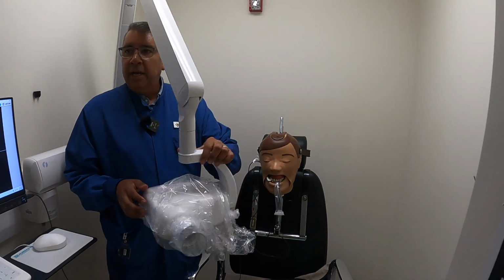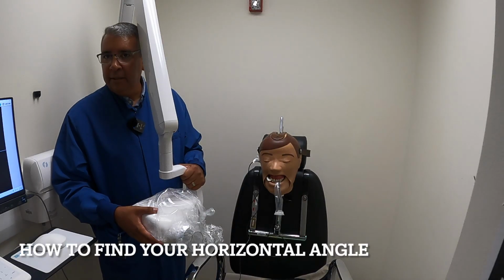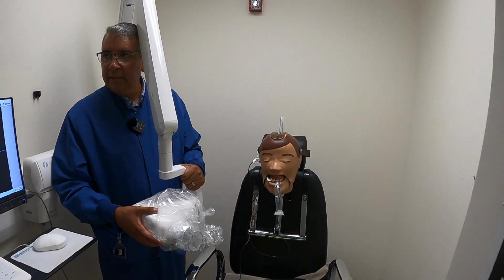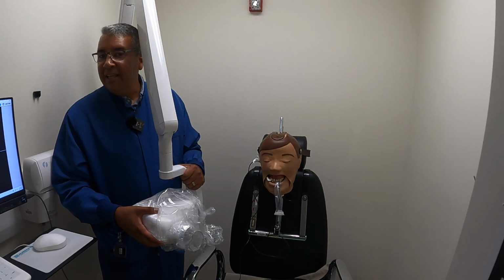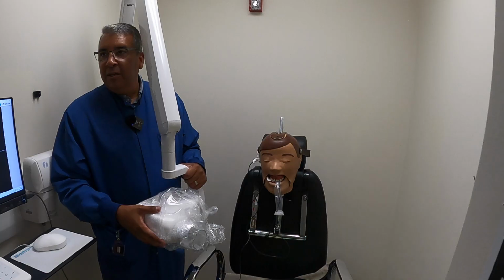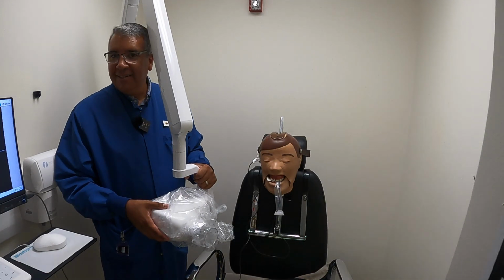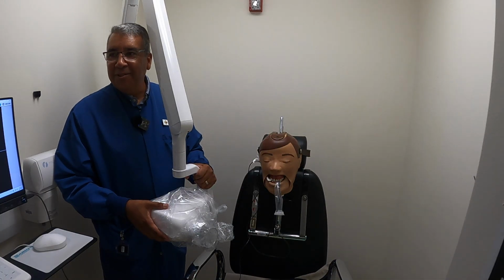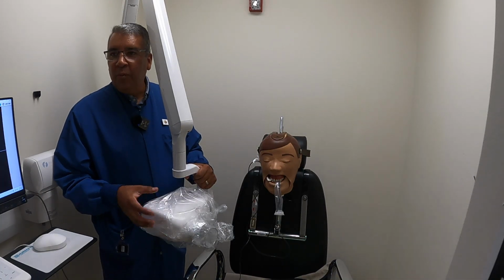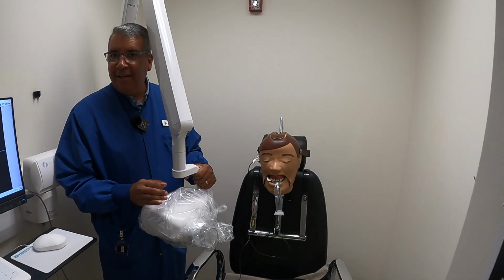Vertical's done. How do I find my horizontal? The center line of the eyebrow or the nose? The center line of your teeth? Nope.